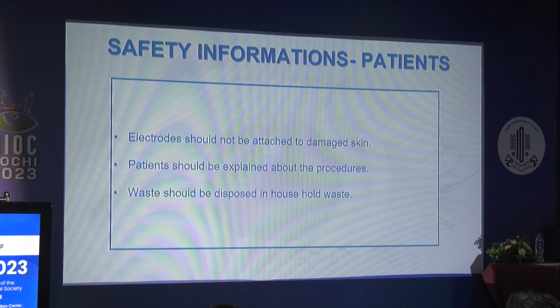Safety information for the patients. The electrode should not be attached to damaged skin. The patient should be explained about the procedure and the waste should be disposed of in household waste.